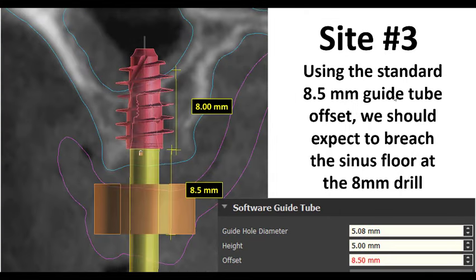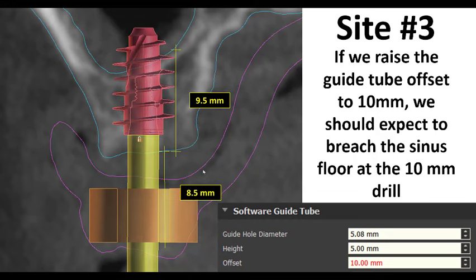Looking at site number 3: using the standard 8.5mm offset, the measurement to the sinus floor is in the 7 to 8 millimeter range. The reason Aaron raised his guide tubes is that the tube was impinging slightly into the outline of her denture scan appliance. Rather than trimming the underside of the guide, he just chose to raise it a millimeter and a half so the tube sits at 10 millimeters with no impingement. That effectively shortens the drill reach by 1.5mm, so instead of breaking through at 8mm, it's going to break through at about 9.5mm — meaning you'd be looking at the 10 millimeter drill.